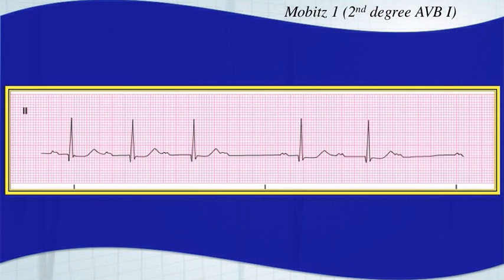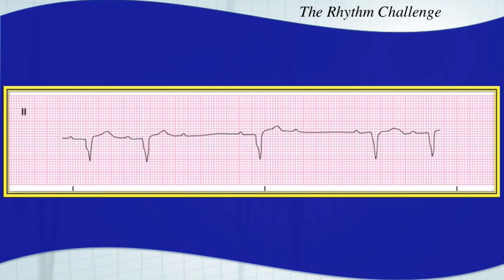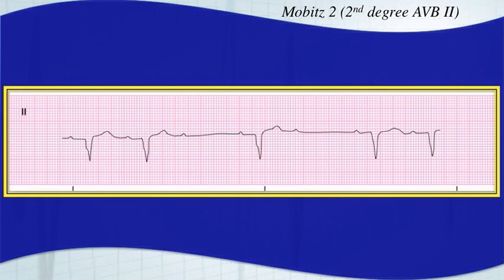Here is your next arrhythmia. Make sure you give it a chance to interpret it. This is a Mobitz II, a second degree type II — a consistent PR interval with dropped beats. Mobitz II: consistent PR interval with dropped beats.